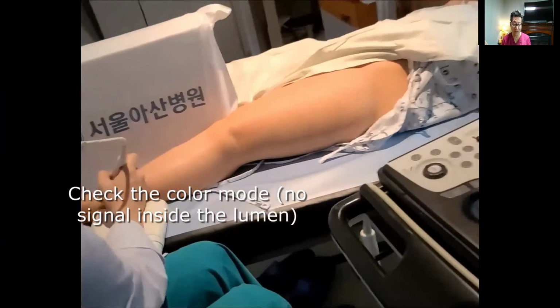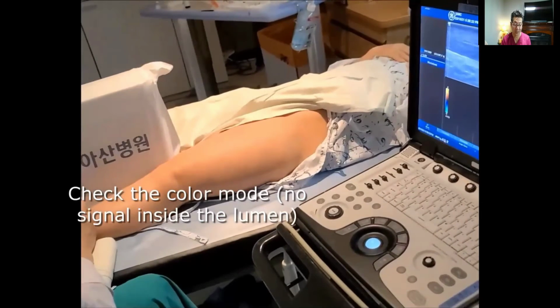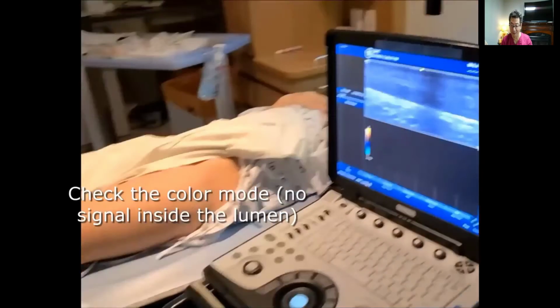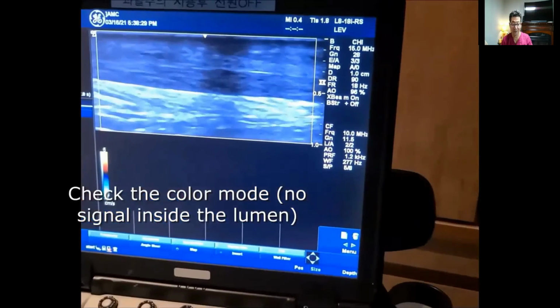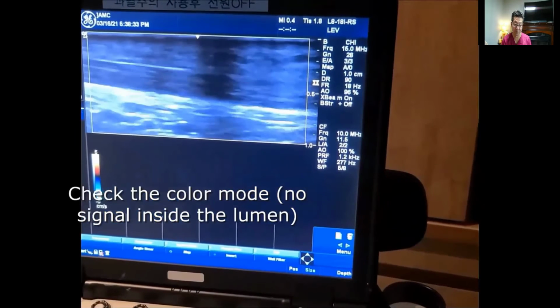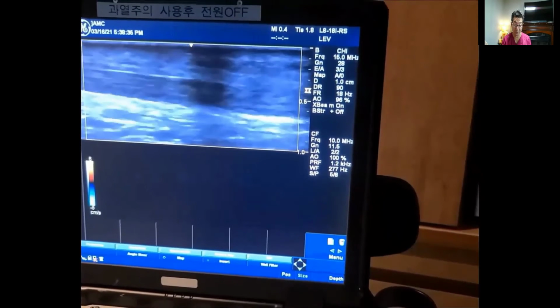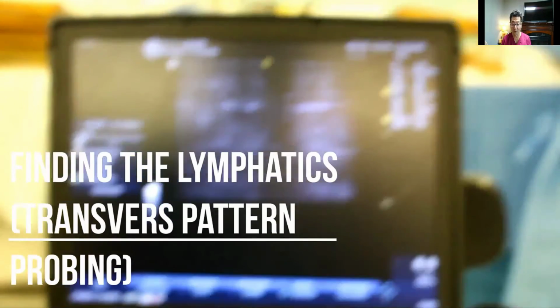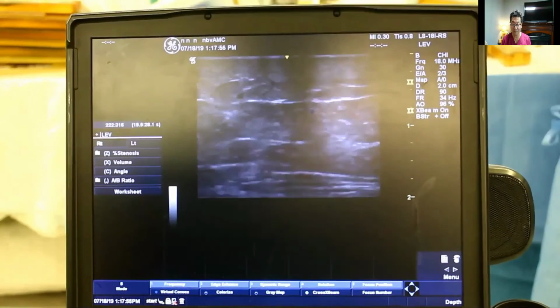What we're doing right now is checking under the color mode. And if there's no filling in the color mode, then we suspect that this is a lymphatic vessel. Now we want to go from the axial to the transverse. And now we're identifying the lumen, as you can see, right underneath the skin. So we're continuing to probe the lymphatic vessel.